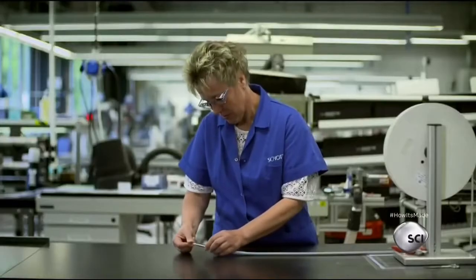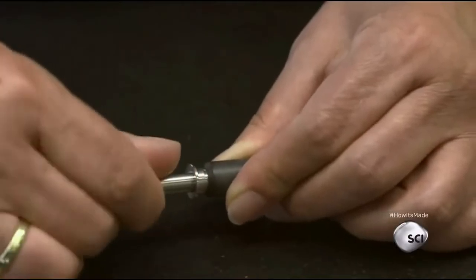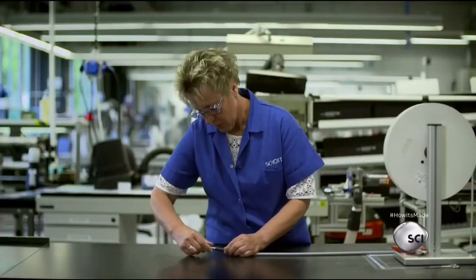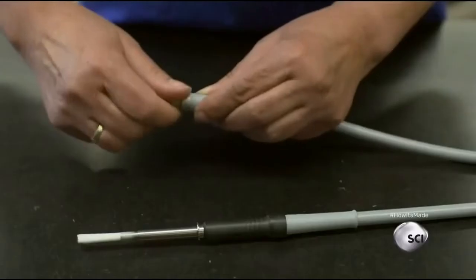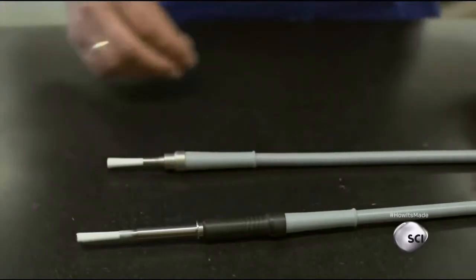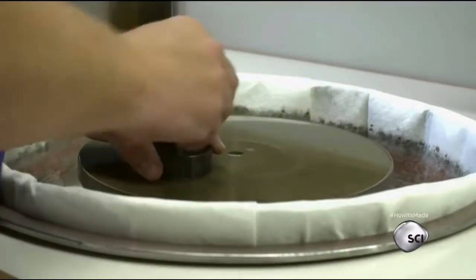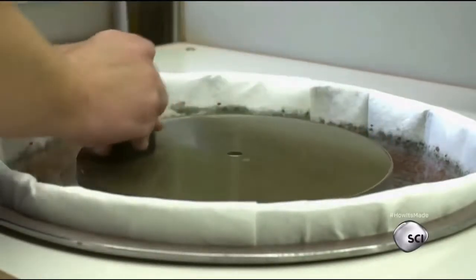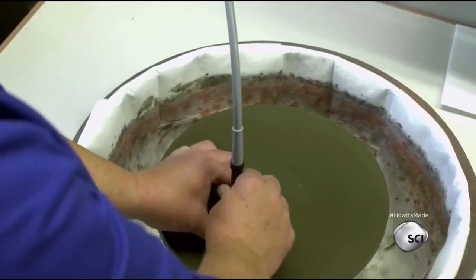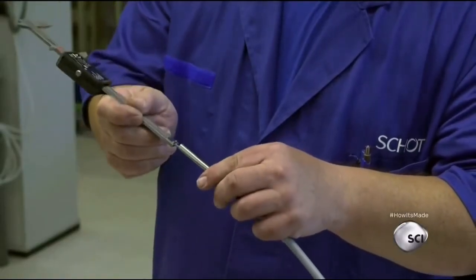She screws a stainless steel fastener called a ferrule onto each threaded end of the sheathing. After saturating the ferrules and optical fibers inside with glue and curing the adhesive with heat, the worker trims off excess fibers and hands off the cable to the next station, where a worker polishes both ends. Polishing finalizes the dimensions and enables light to shine through.